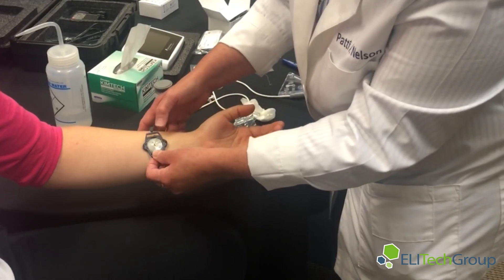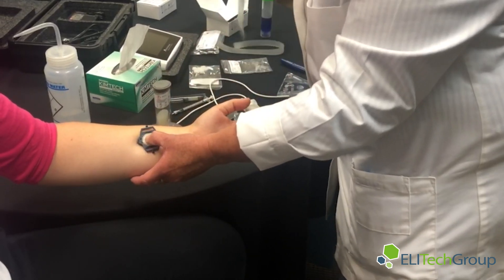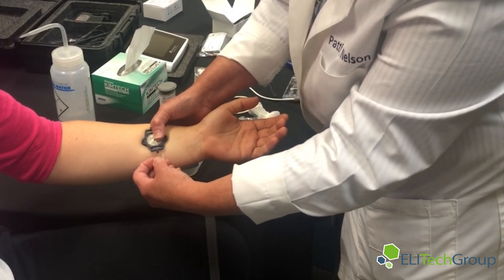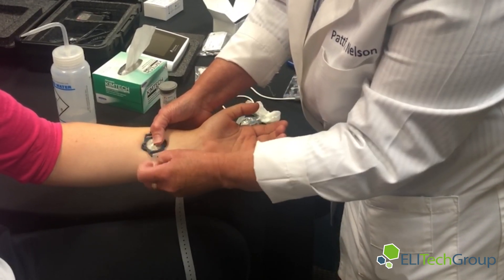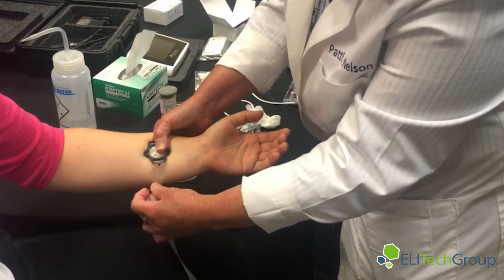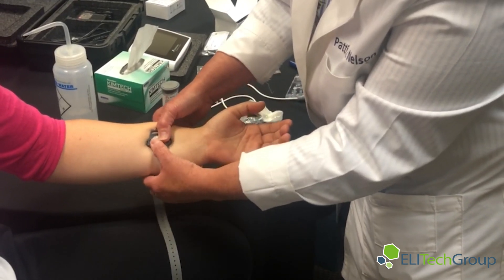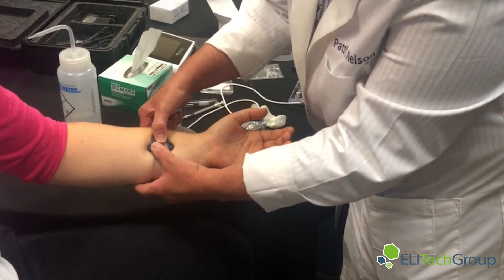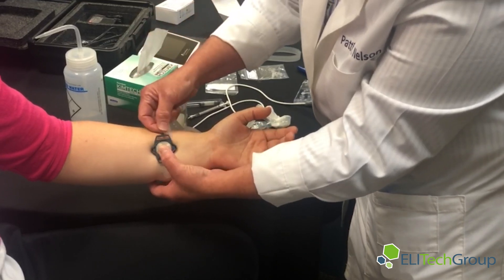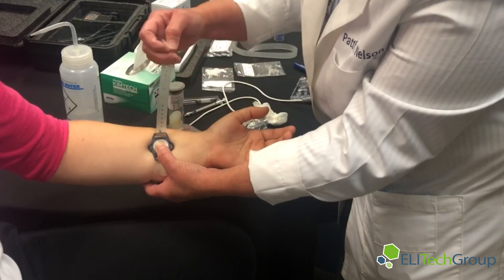Now you put it directly over the spot where you had the red electrode. Take a strap — you can either attach it to the collector before you start or at this point. Just put the post through one of the holes. Make sure that you always keep the collector in the same spot — you don't move it. You may have to push onto the arm a little bit, but make sure it's in the same place as the red electrode was.